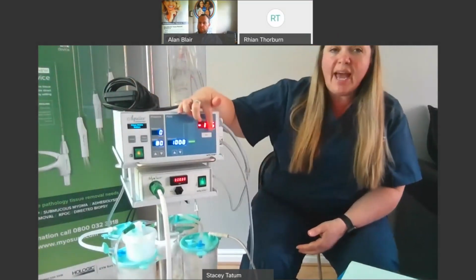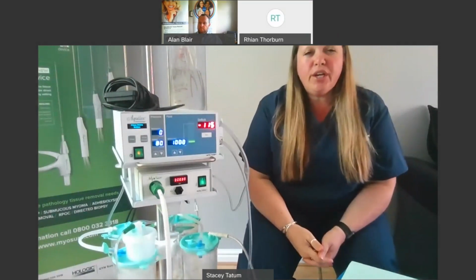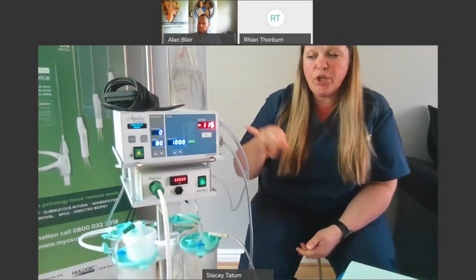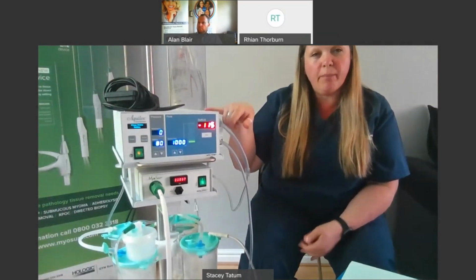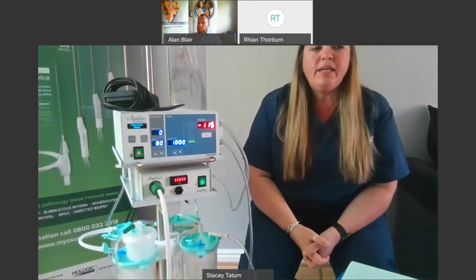And once you'd zeroed it out, you'd be able to get on with the procedure, and then at the end of the procedure, you would add the current deficit to the one you jotted down before the reprime, and that would be your fluid deficit.